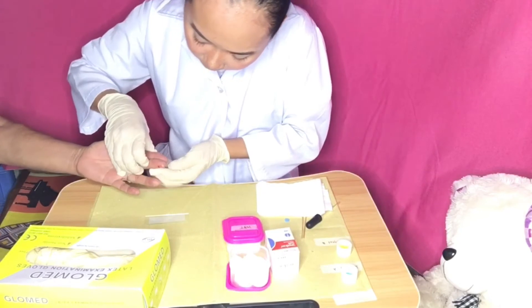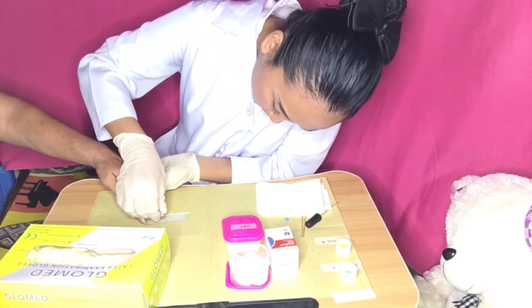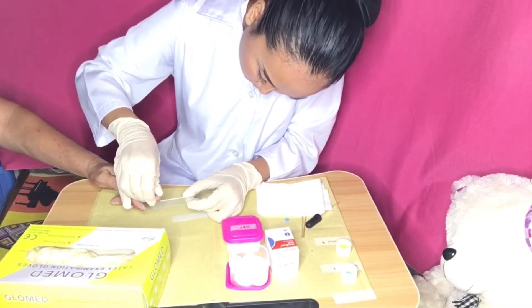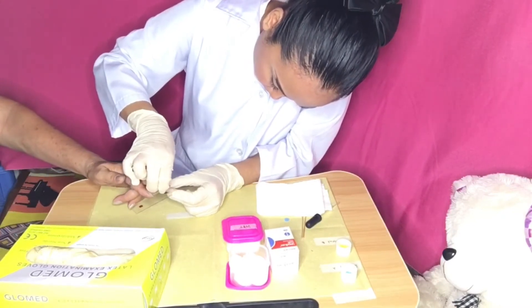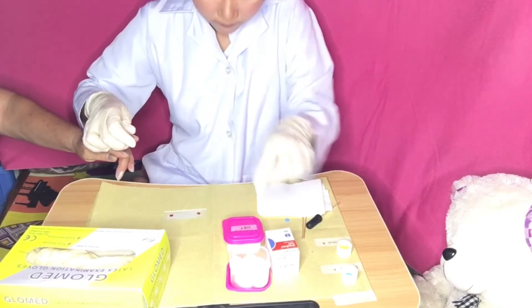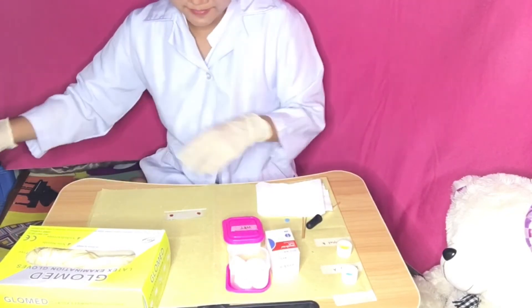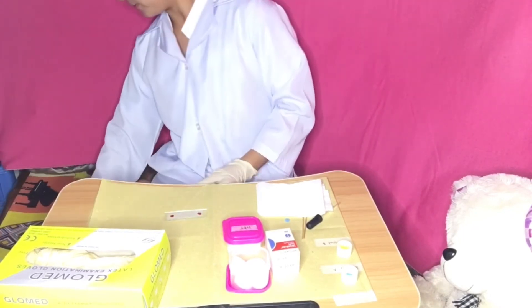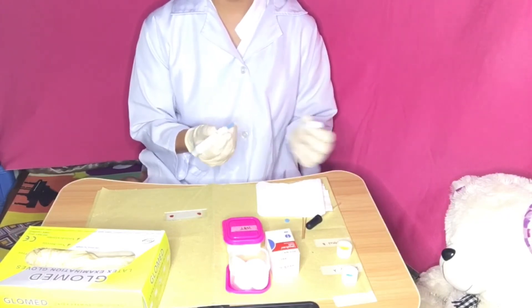Place a drop of blood on a glass slide on each end. If you are using a capillary tube, refer to the procedure for health assessment skill of collecting blood using a capillary tube. Ask the client to apply pressure to the skin puncture site with a cotton ball.